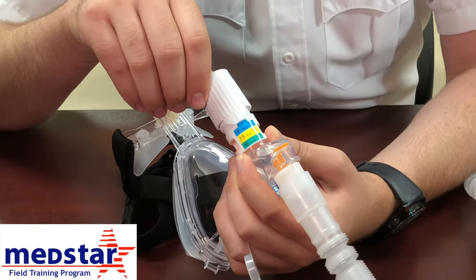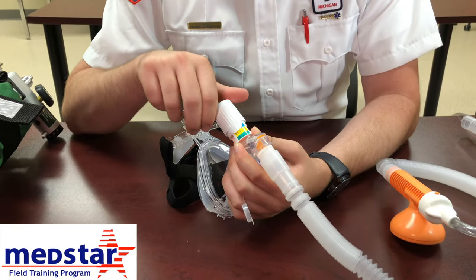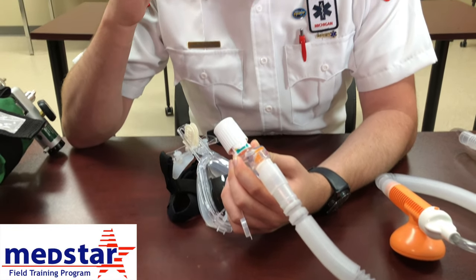Generally, with severe respiratory distress patients, we would start between 7.5 or 10, depending on how severe they are.